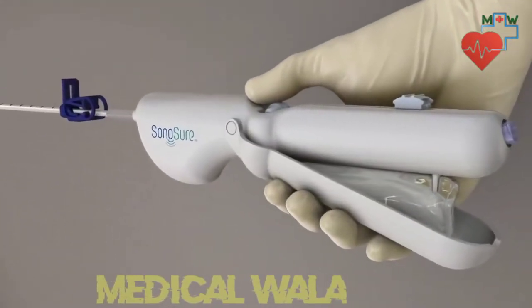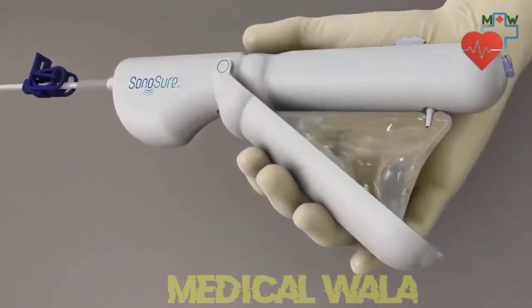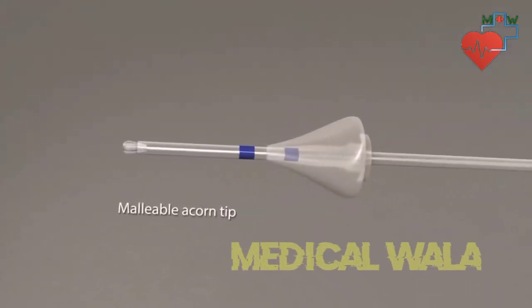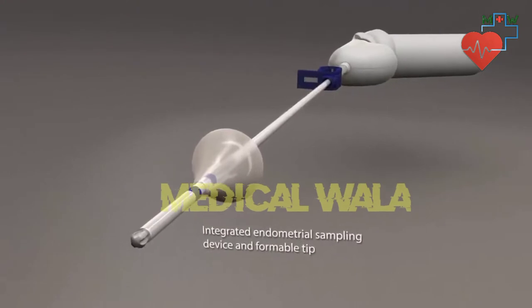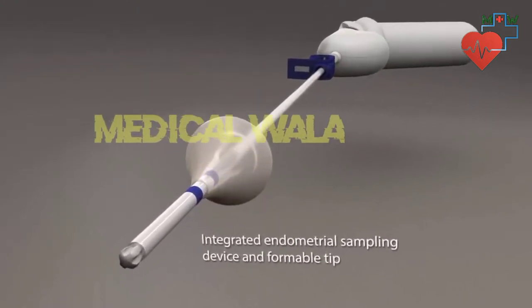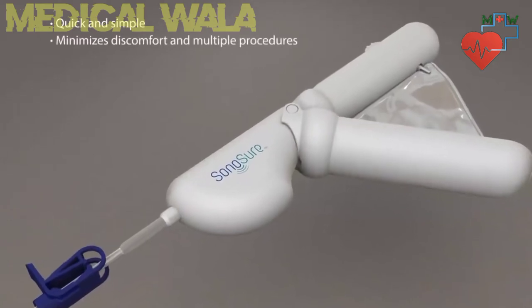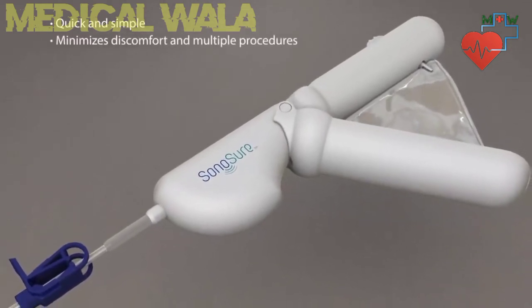Sonosure is designed to be operated with one hand. Its unique features — refillable fluid bag, malleable acorn tip, integrated endometrial sampling device, and formable tip — allow for a quick and simple procedure, minimizing discomfort and multiple procedures for the patient.